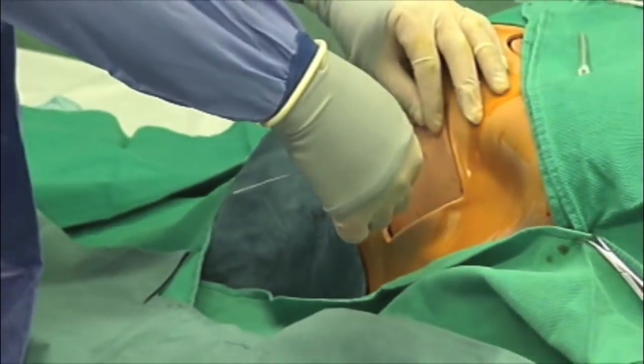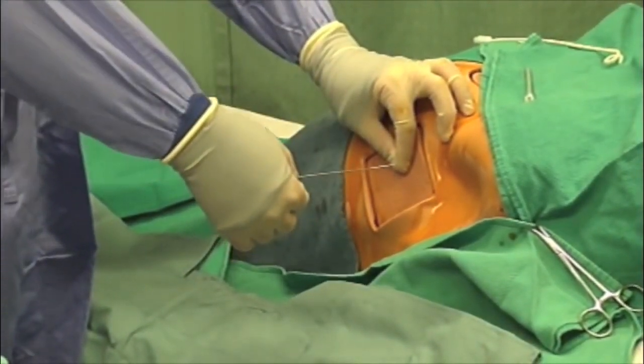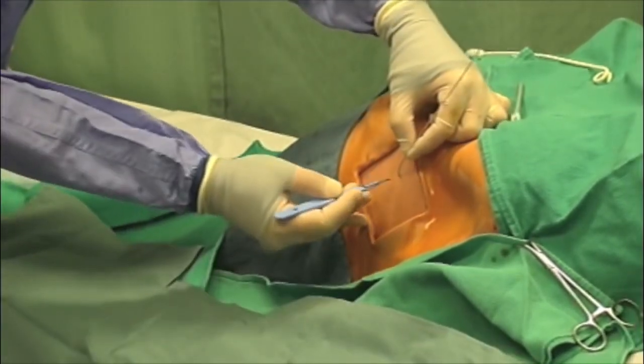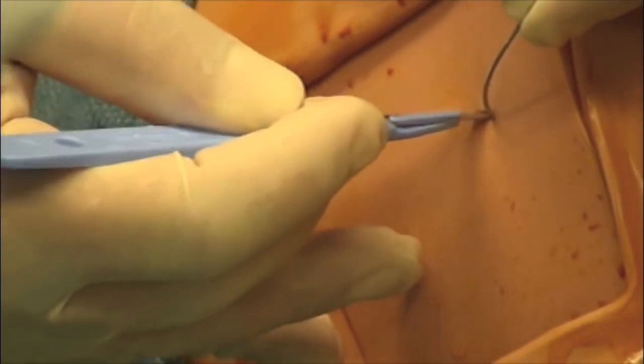Withdraw the needle, leaving the guide wire in place. Pierce the skin adjacent to the guide wire with the scalpel.